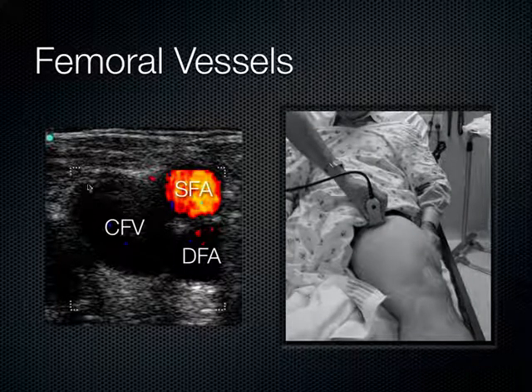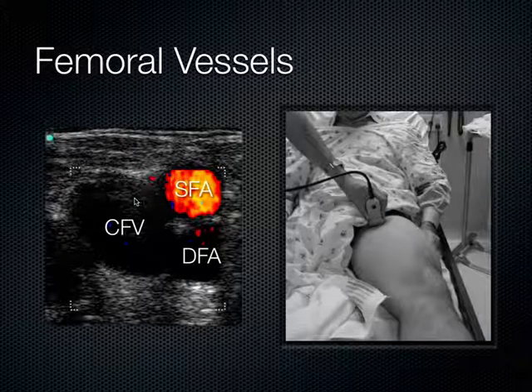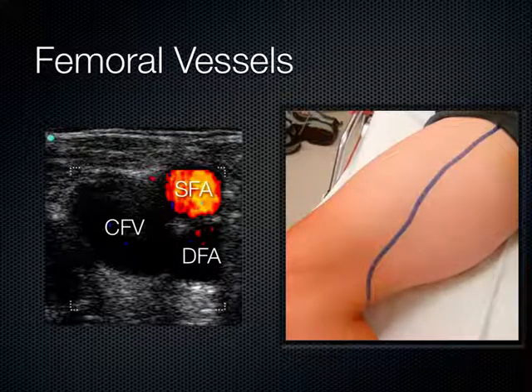Venous is closer to the penis. Venous, penis, it rhymes. It's easy to remember. Sometimes you get all twisted around, you're not sure where you are. So in this case, this would be the left leg. And superiorly, we have this medial lateral configuration, but as we march distally, these structures become anterior posterior pretty quickly. And that's the location of the femoral vein.